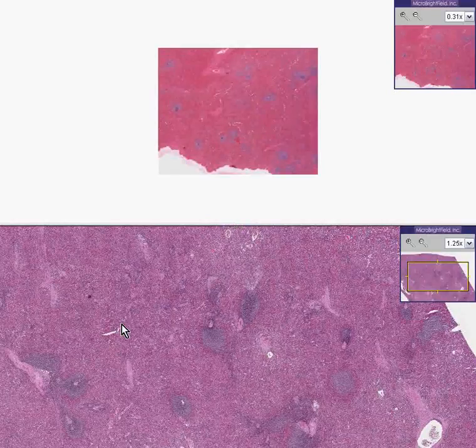Well, you know this is a spleen because it looks like a spleen. You could see these lymphoid areas like here, here, here. It looks like less than half, maybe a fourth of the cross-sectional area is lymphoid, and therefore this is the white pulp of the spleen because it looks white grossly. And the areas between these lymphoid areas, which look red grossly, are the red pulp.